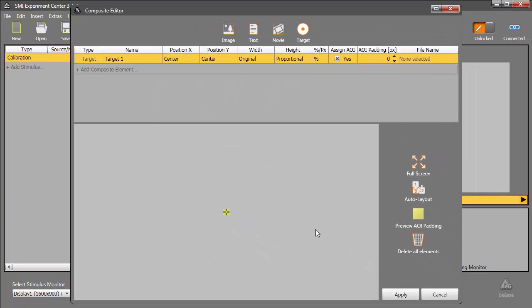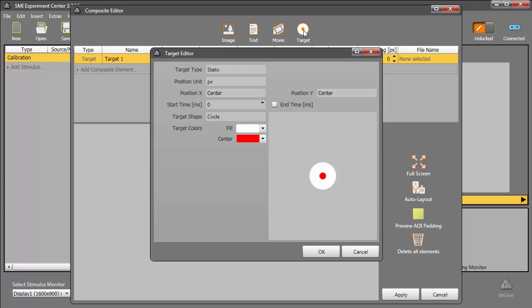At this point, our target appears at the beginning of the stimulus and disappears two seconds later. In the same composite stimulus, let's add another target that appears on the right side of the screen when the first one vanishes. I'll click Target again.